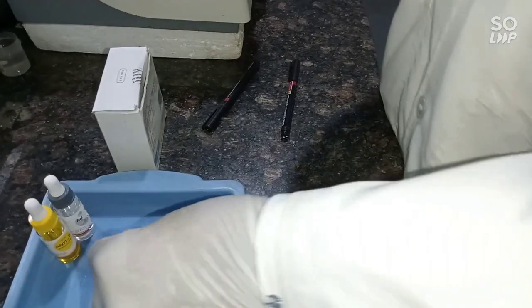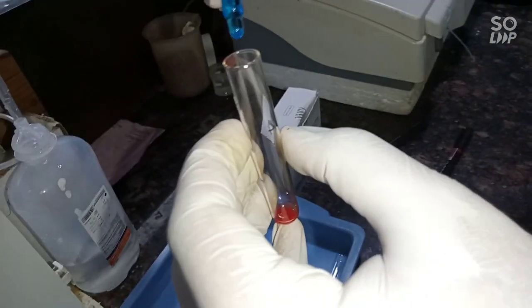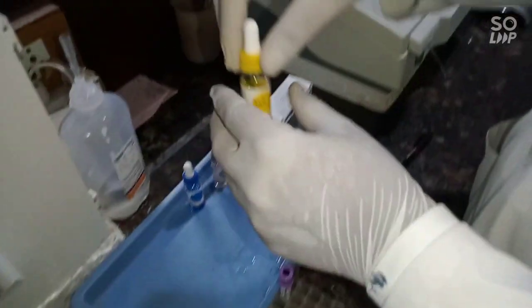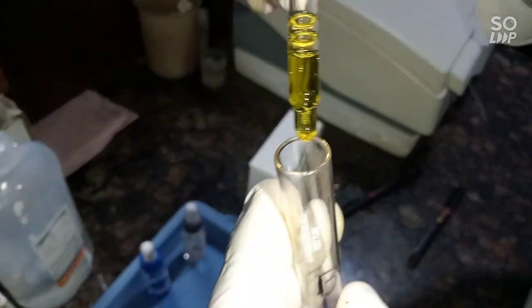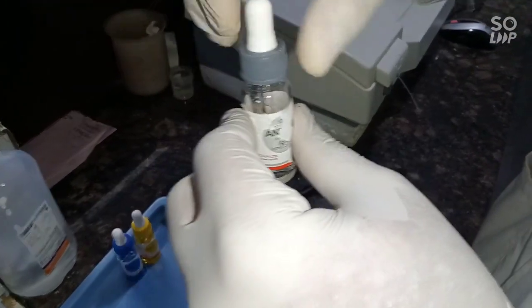This is anti-A — it is blue-colored. Carefully add one drop of anti-A into its respective tube. This is anti-B — it is yellow-colored. In the same way, add this into its respective tube. This is anti-D — it is colorless. Add this also into its respective tube.